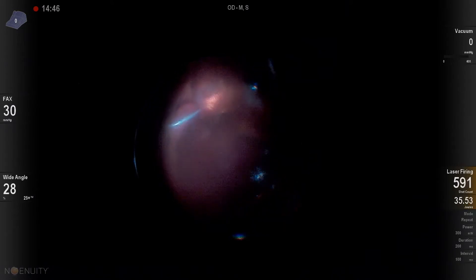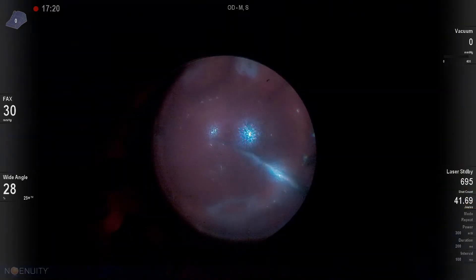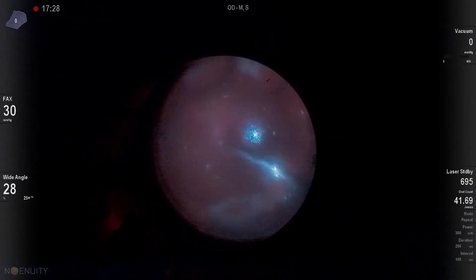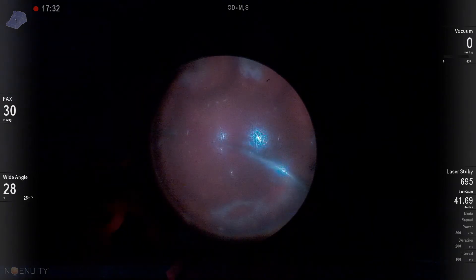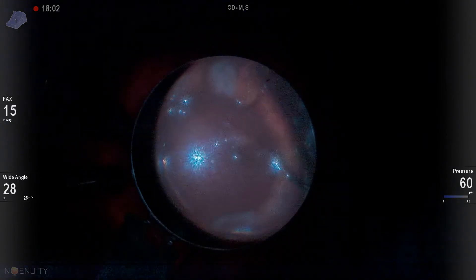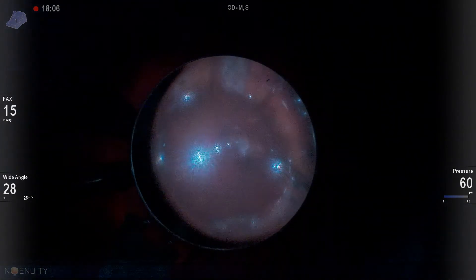Here we're lasering on one of the two 106s down below. She had two tears down below, both of which fell on that 106. Going back and taking just a little more fluid off from around the break — if there's any there, there's really not. And we drain her over the nerve. She is totally attached here. She's got this giant buckle and her breaks are all on the buckle. I thought we had a win in this patient.